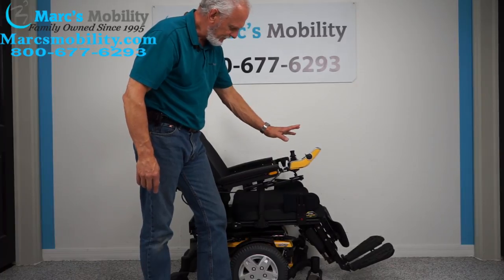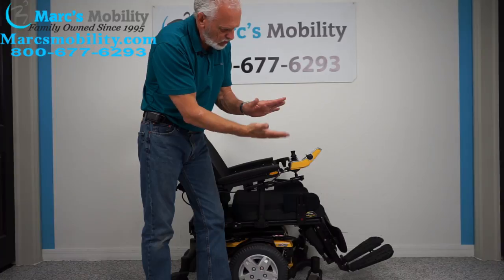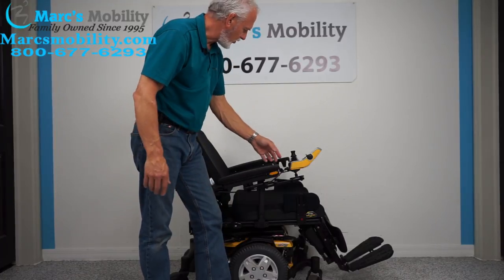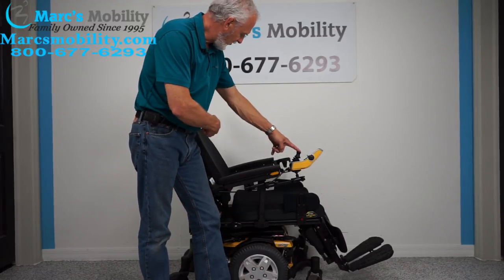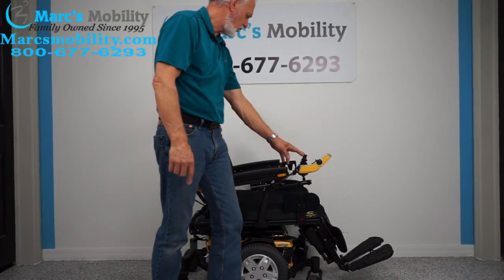Leave your legs out like this when you're outside — it gives you a little more room under your feet in case you happen to hit a curb. Now I'm just going to bring the back forward by itself a little bit more.